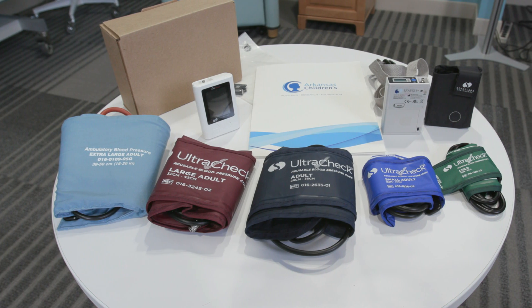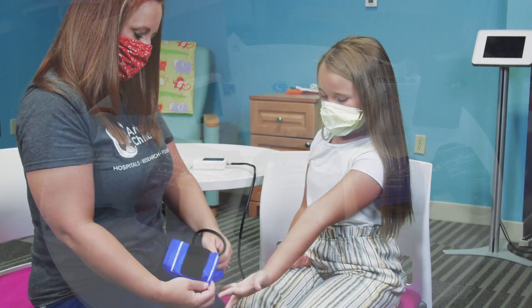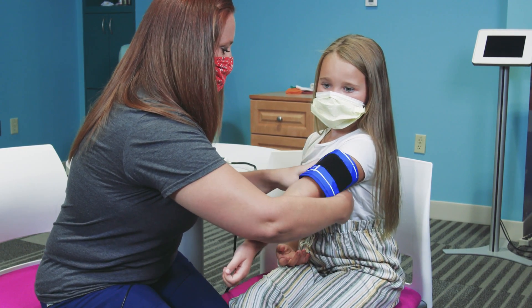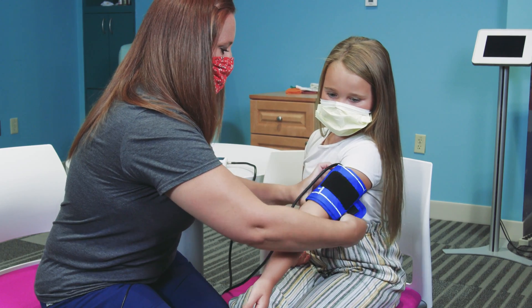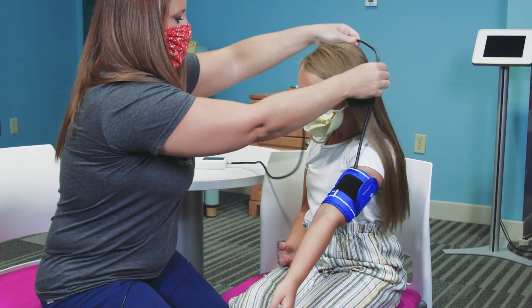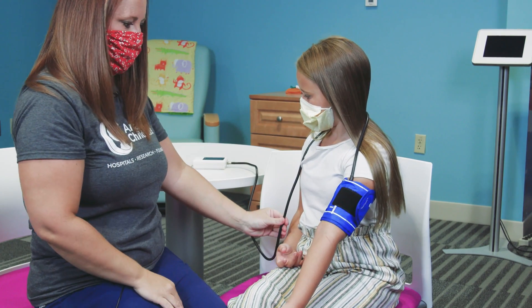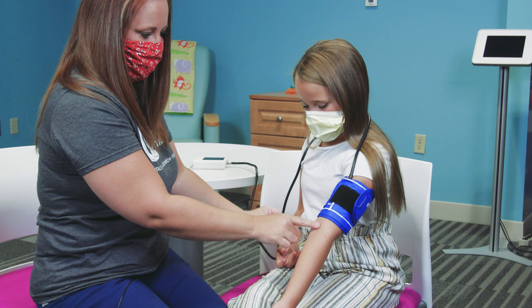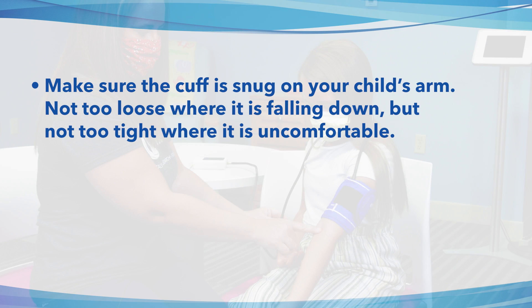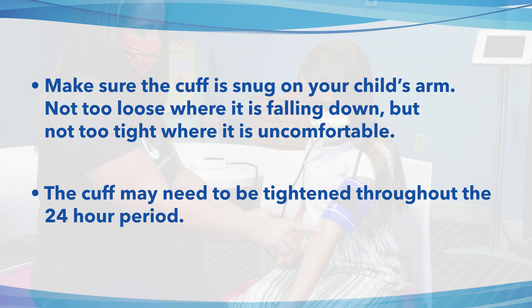Now you can place the blood pressure cuff. First, apply the cuff to the non-dominant arm. For example, if your child is right-handed, put the cuff on the left arm. The cuff needs to be worn on bare skin. The marker on the cuff should follow the artery line. Make sure the cuff is snug on your child's arm — not too loose where it's falling down, but not too tight where it's uncomfortable. The cuff may need to be tightened throughout the 24-hour period.